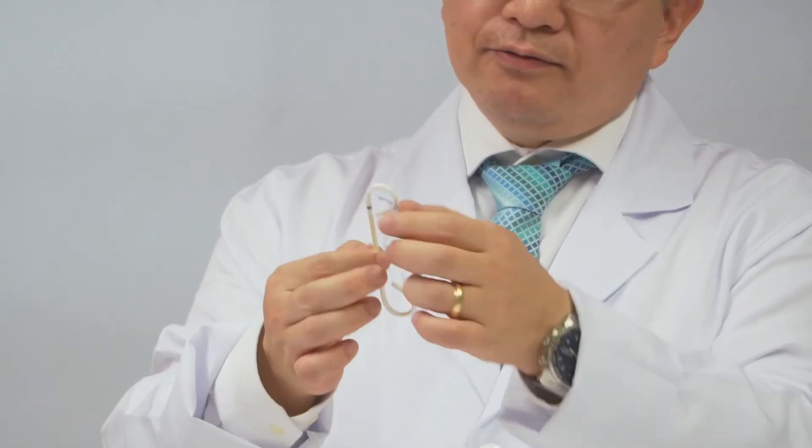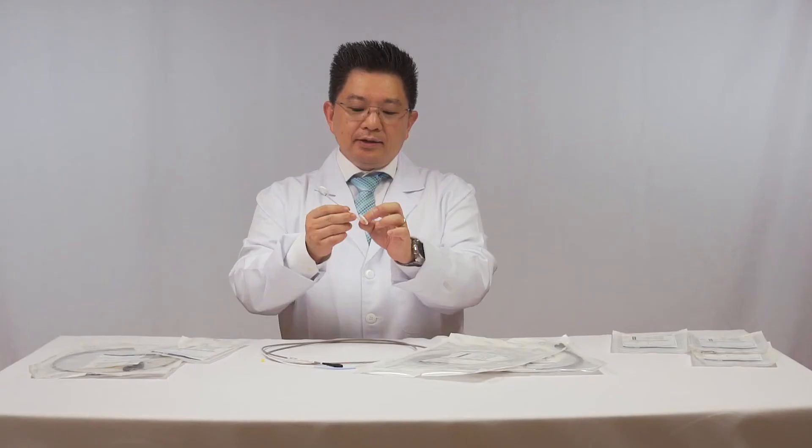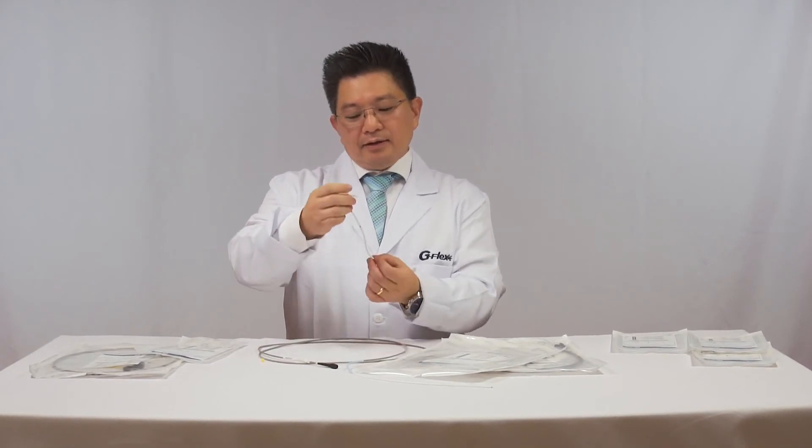It's very useful when you have a big sphincterotomy. There is no way to anchor conventional plastic stents in that situation. It's very useful in situations like after lithotripsy and large sphincterotomy.